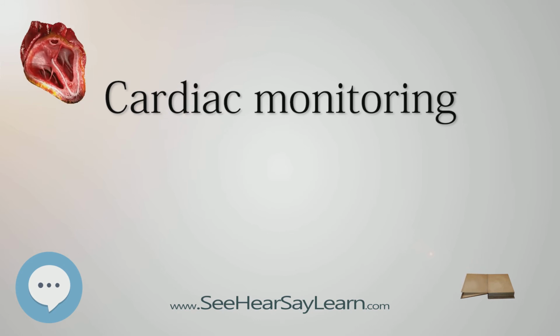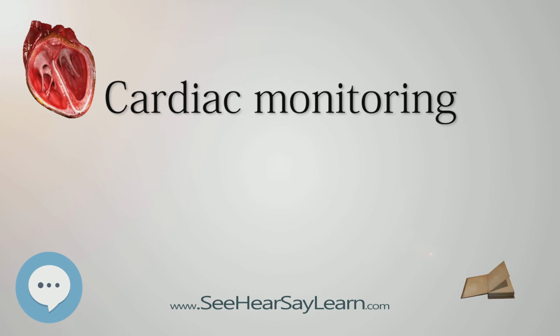Heart rate monitoring. Monitoring of the heart rate can be performed as part of electrocardiography, but it can also be measured conveniently with specific heart rate monitors. Such heart rate monitors are largely used by performers of various types of physical exercise.